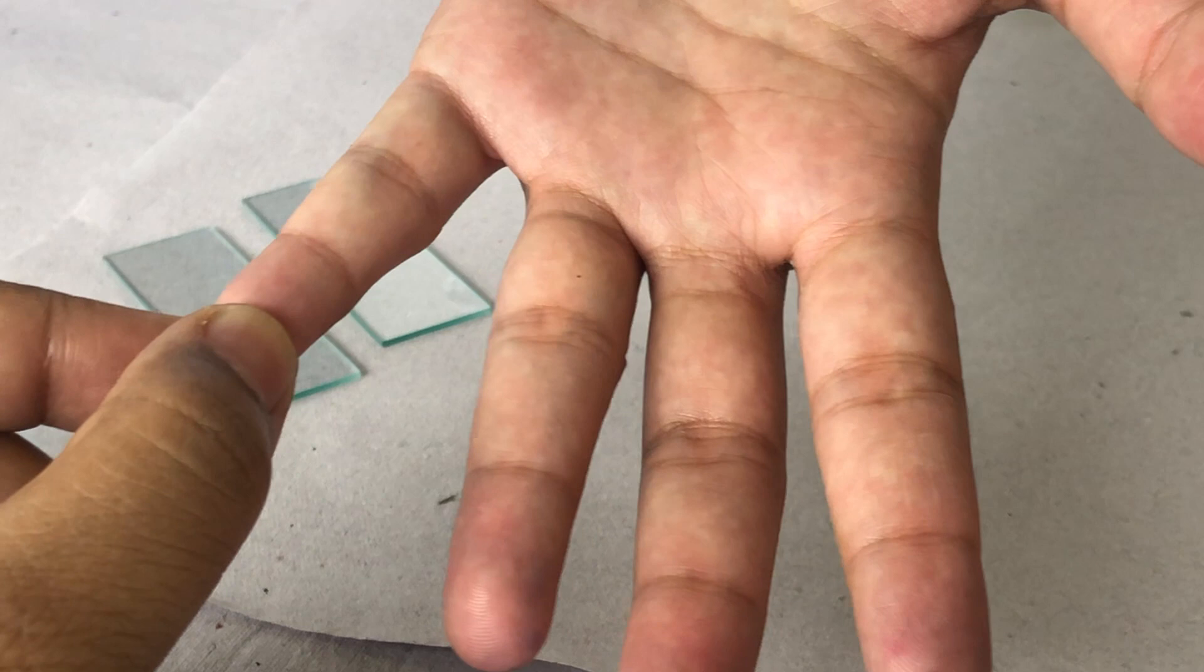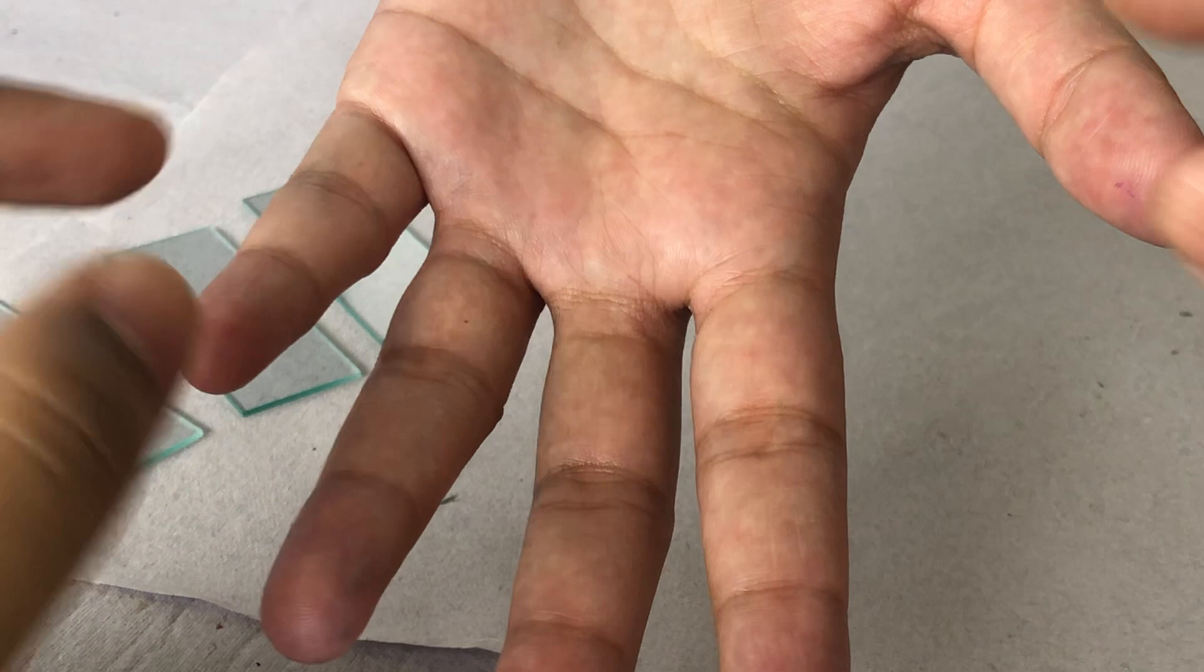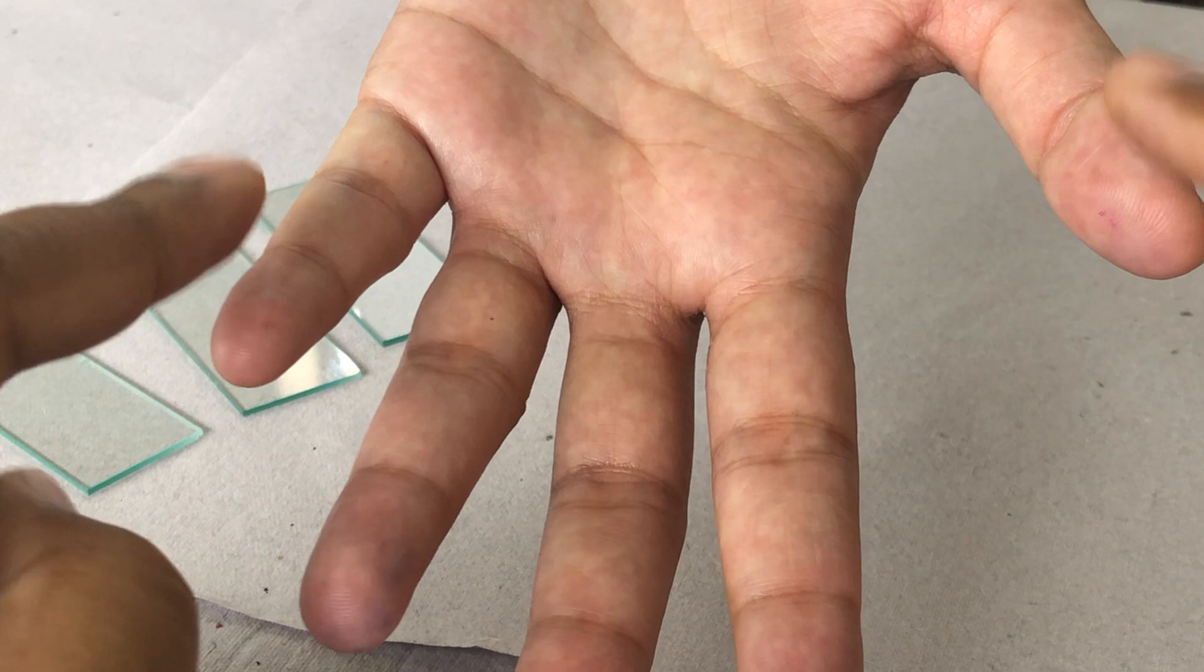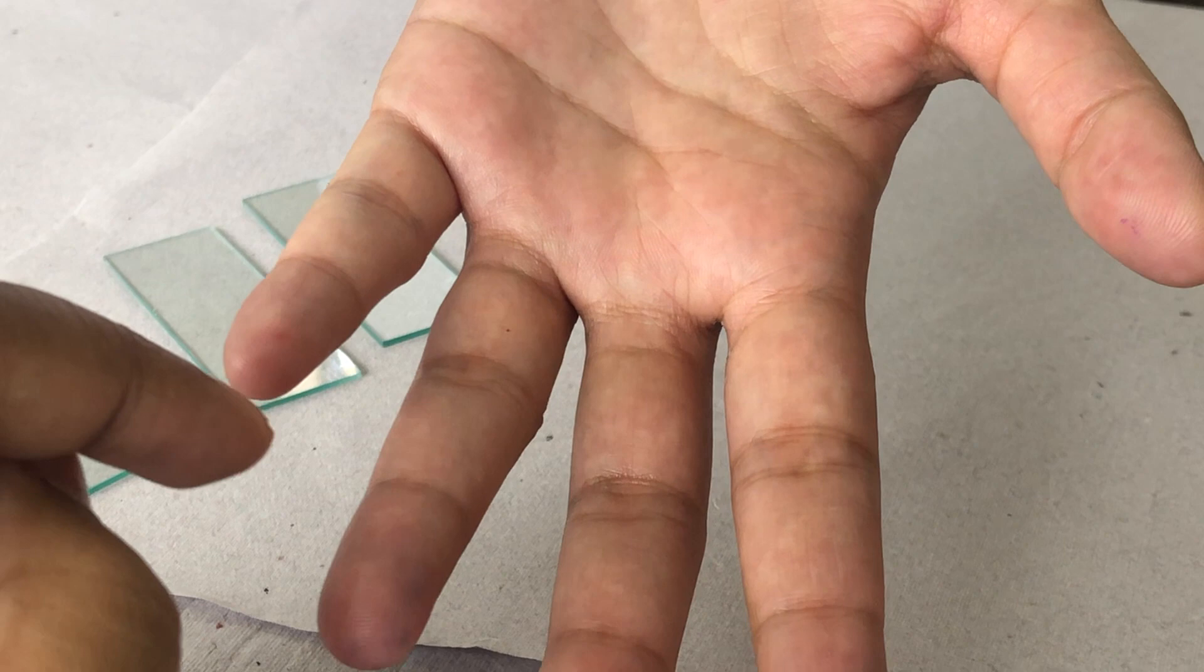The thumb and the little finger are not to be used. The reason being that the fascia underneath are passing under the wrist into the forearm. Therefore, any infection on the thumb or little finger can transfer the infection into the fascial compartment in the forearm.